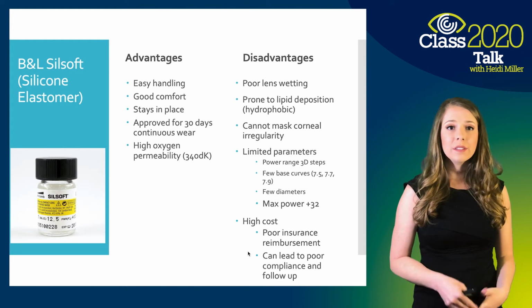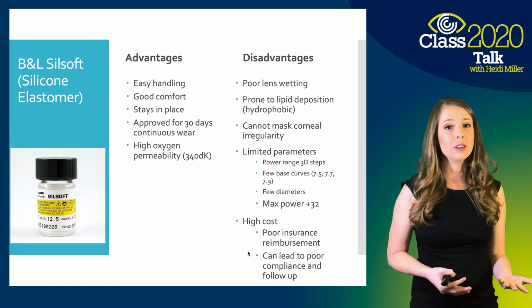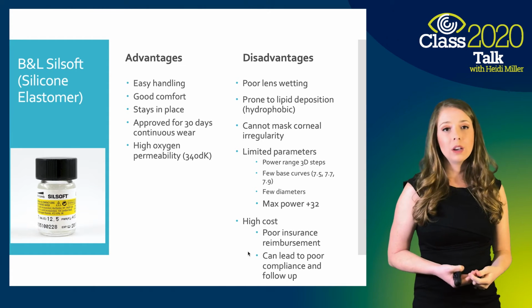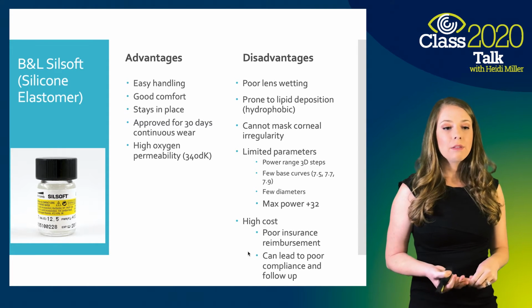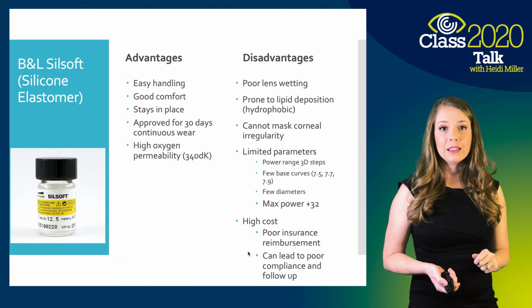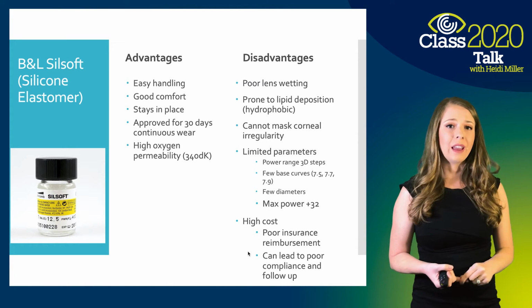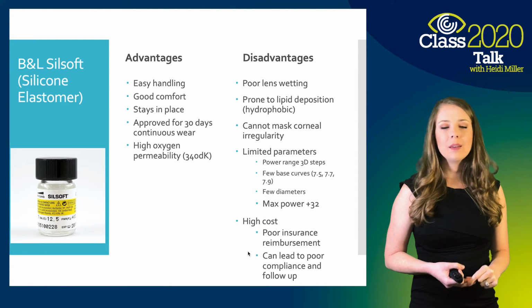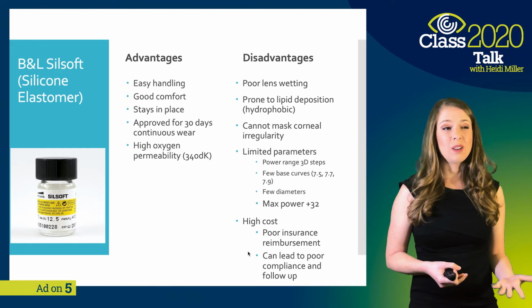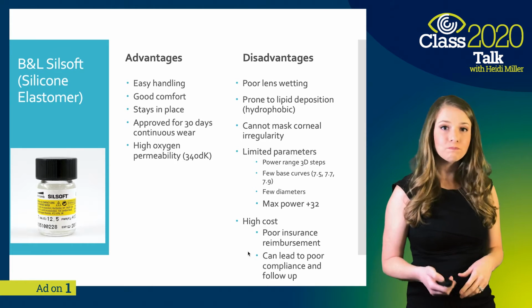Each patient's going to be different. Each situation's going to be different. But if you're noticing kind of a pattern of lens loss, it may be a good idea to switch to something that has better cost. The other thing to keep in mind is that cost is a lot of times the driver for compliance and follow-ups. And so putting them in a lens that they're going to be successful with, and it's also not going to be a financial burden, may be a better idea too.